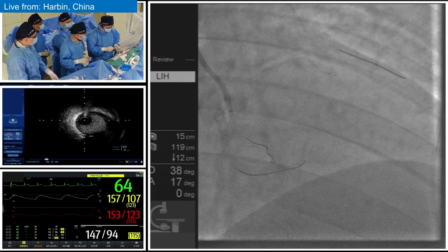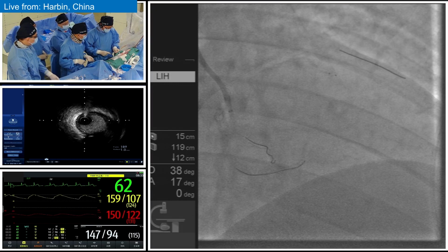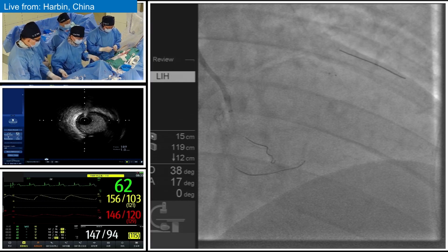Creating such a small bend, like I said 1 to 1.5 millimeter, 30 to 45 degrees, can only be accomplished by inserting the guide wire through an introducer, as Professor Li is doing currently. So we want to avoid making this curve, especially an antegrade CTO wire curve, using the side of the introducer. We strongly suggest you insert the guide wire and use the tip of the introducer to make this curve.